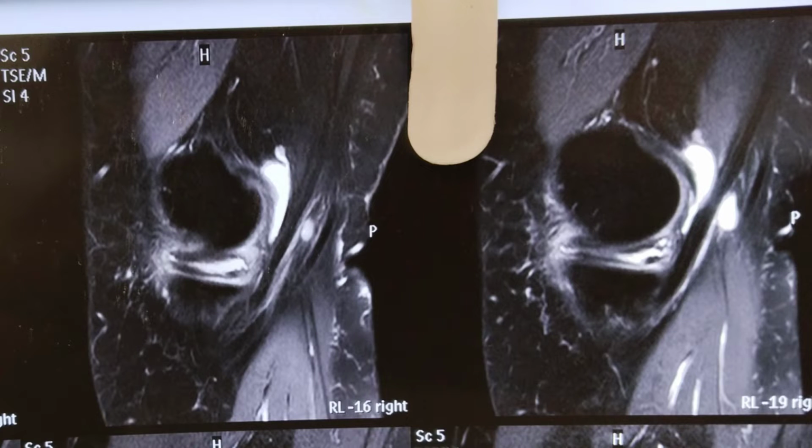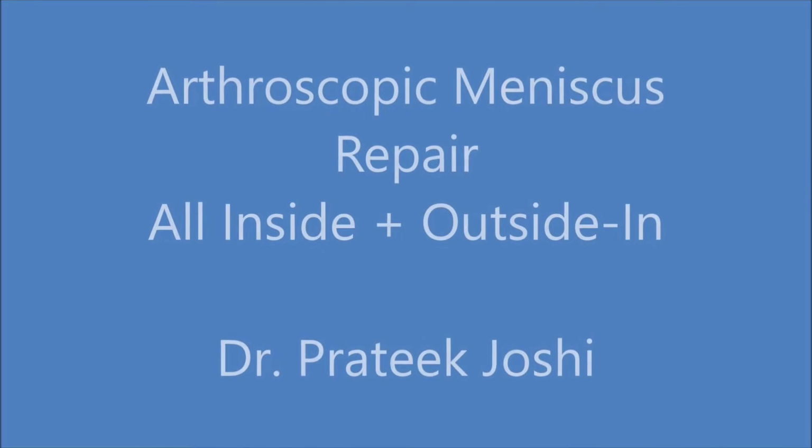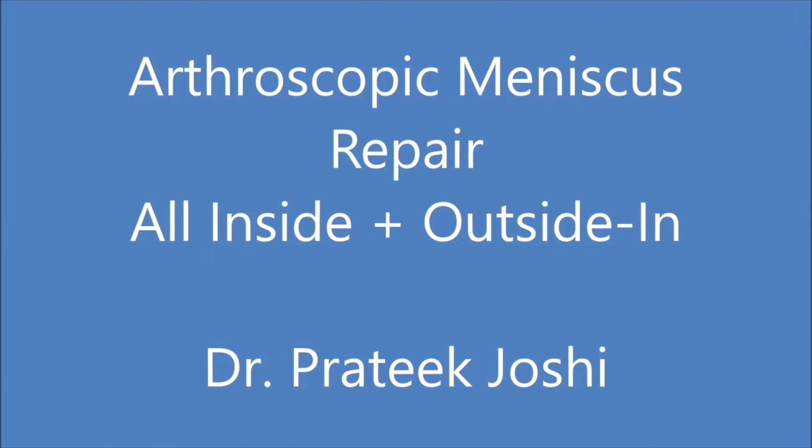So these are the T2 sagittal MRI cuts of the right knee joint, and as you can clearly see that there is tear involving posterior horn of the medial meniscus, and it is extending to the body. So now let's start with the arthroscopic meniscus repair procedure.